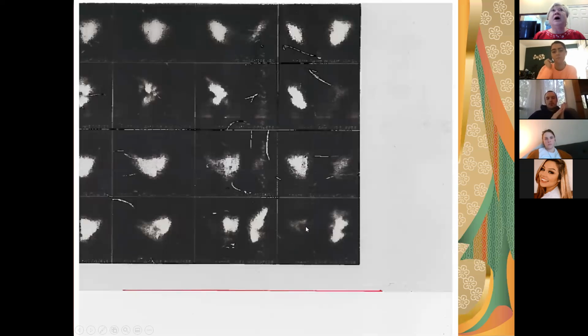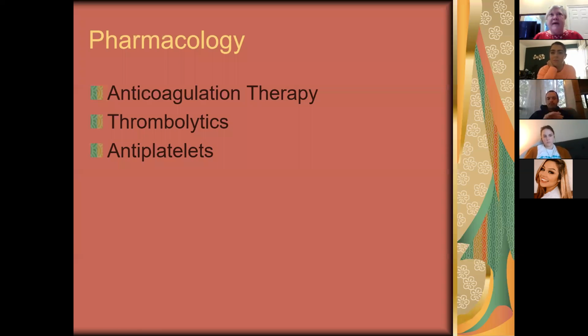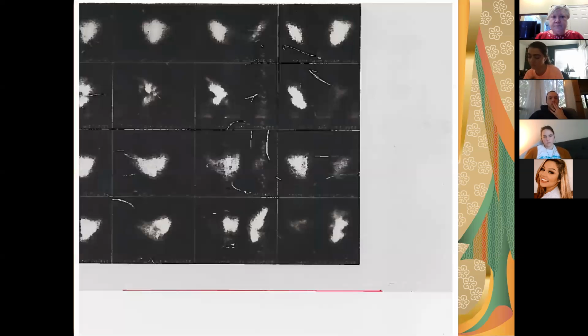All right. So the fact that the radioisotope did not go equally through the vasculature of the two lungs, when this was interpreted by the radiologist, it was interpreted as a high probability of a PE, that there was a blood clot that is blocking the lung field over here on this lung. I don't know why. I mean, I don't know if they flip it or what. I don't know, but it was that lung that was the problem, and that's what a VQ scan was.